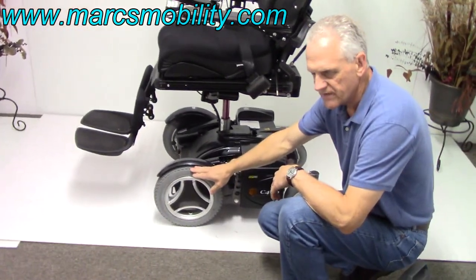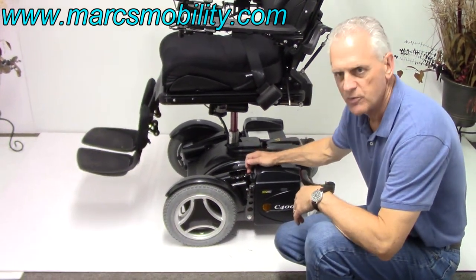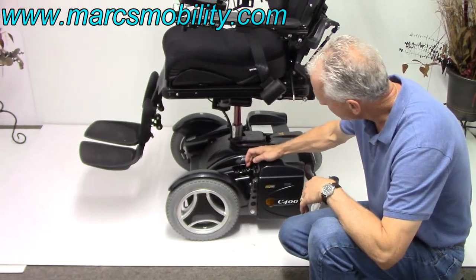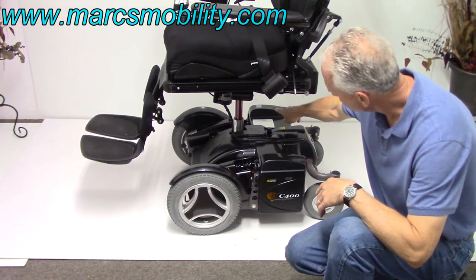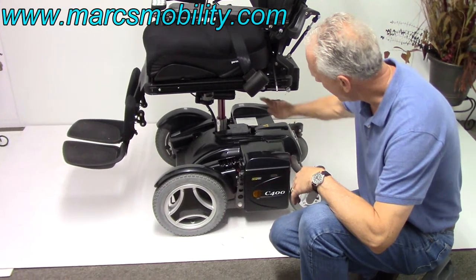We've got 12-inch solid non-skid tires right here. We've got great suspension like all Permobil — this is the suspension right here. You've also got two batteries in this chair. There's one here and one on the opposite side. They come out by lowering this door down and lifting the shroud up.